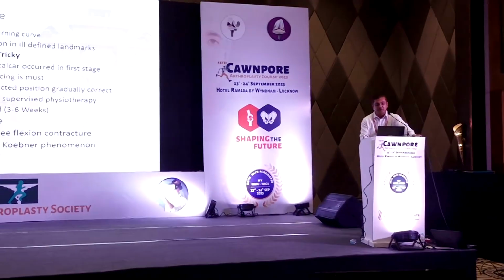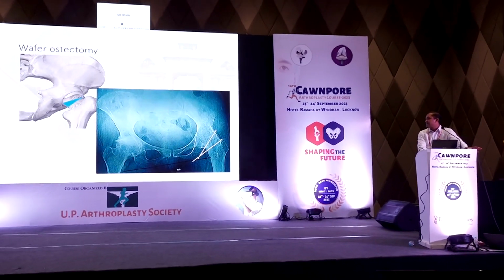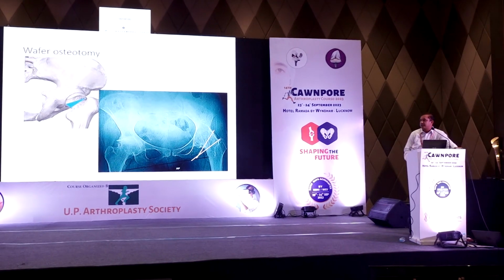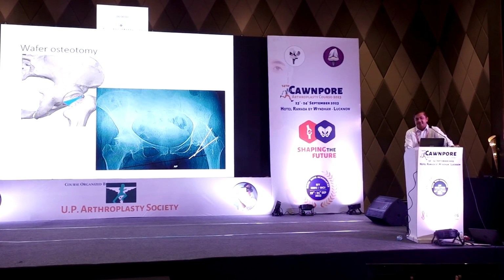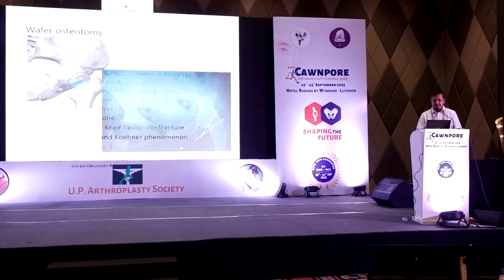That is a bony ankylosis, yeah, correct. So the take-home message was that someone who has no experience should not try such cases or osteotomy, at least in an ankylosed hip. If somebody has no experience, he should not try the neck cut. That's in a bony ankylosis, but this other one is not a bony ankylosis. Anyway, very well done, very well done.